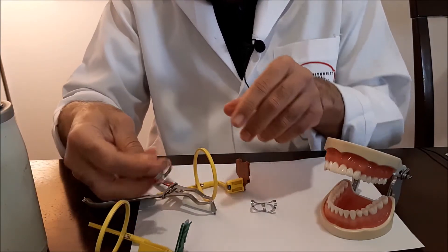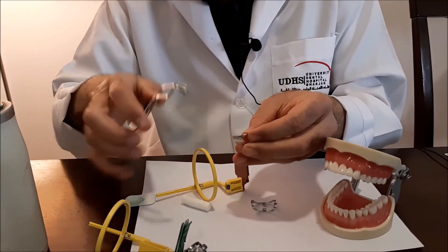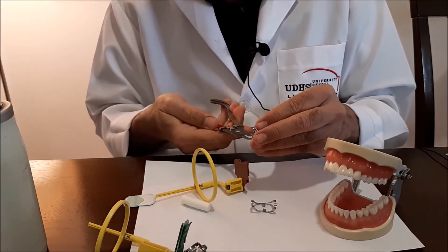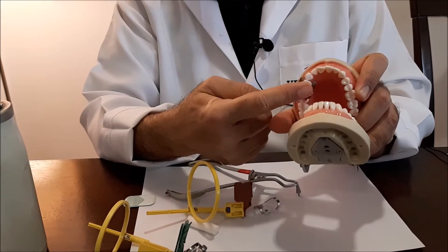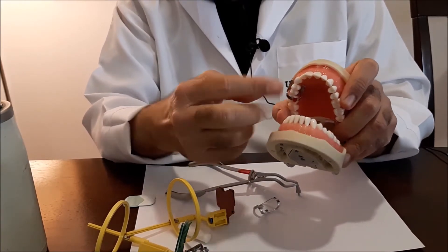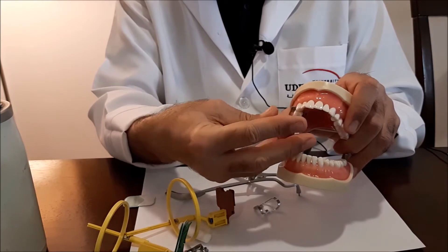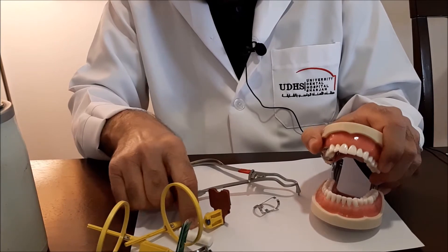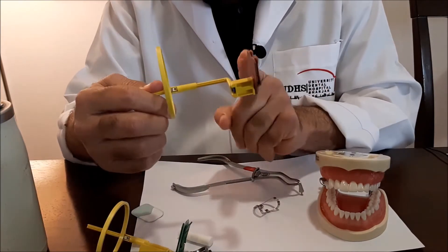For example, when working on a premolar, use this wingless type clamp. Place the clamp on the premolar tooth. Of course, you remove the frame and collect all the rubber dam, setting it aside, and press on it. Now let's see how we place the sensor holder.